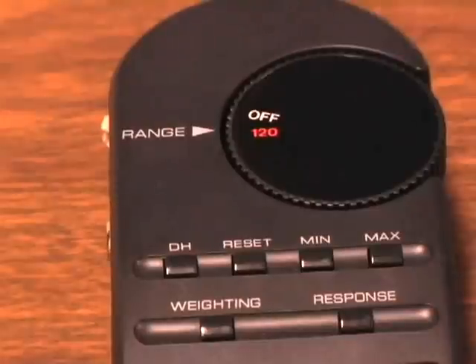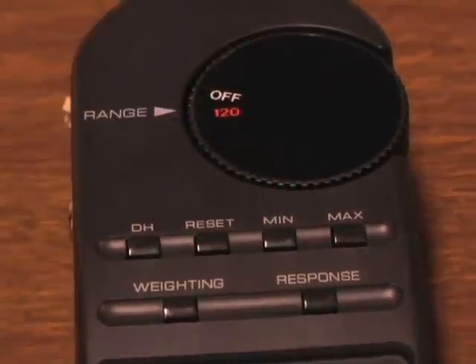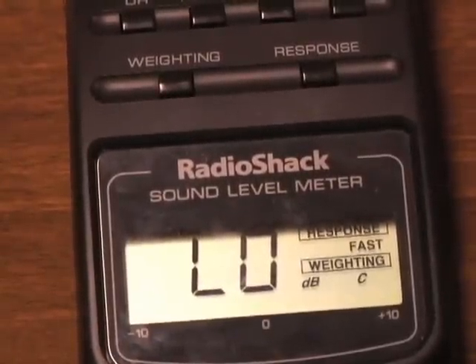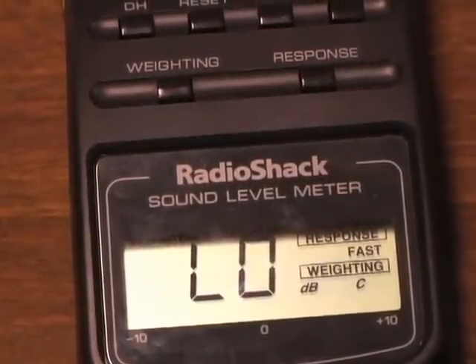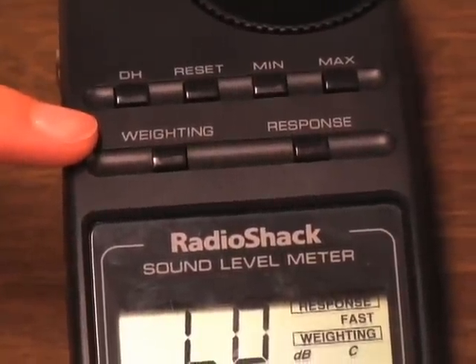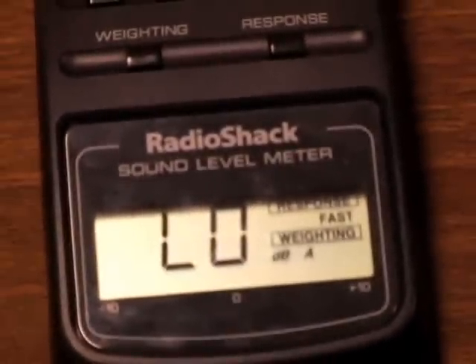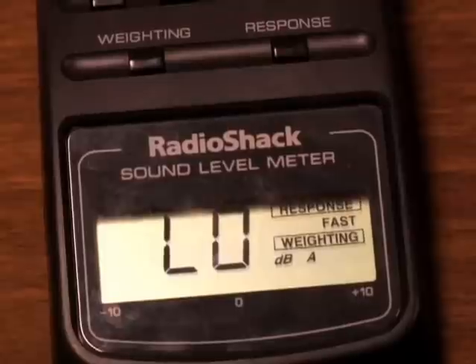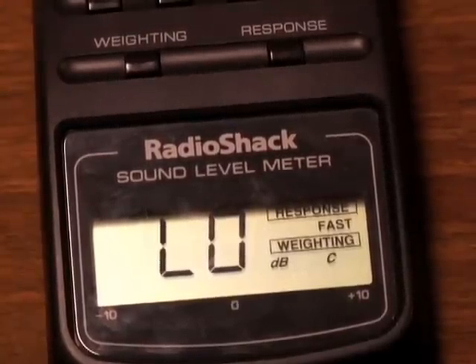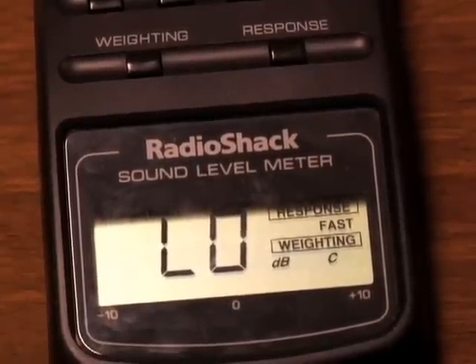It can also display the max, min, and average SPL of the sample. It also has two switches for changing the meter's frequency responses through the weighting button. Button A makes it more sensitive to frequencies in the 500 to 10,000 Hz range, and option C makes it more or less uniformly responsive over the frequency range from 32 to 10,000 Hz.